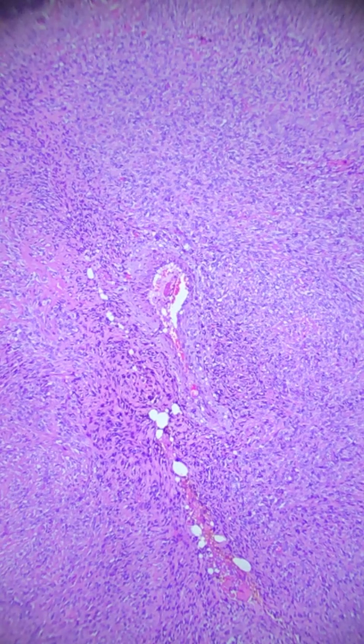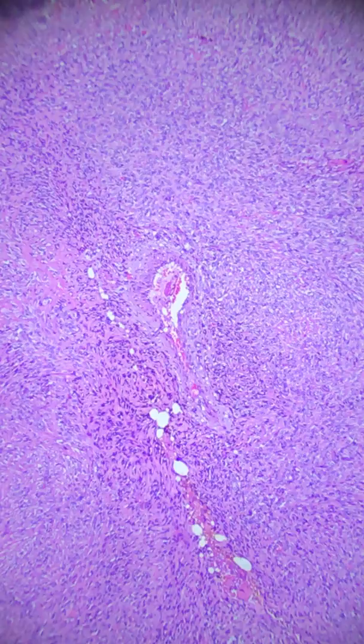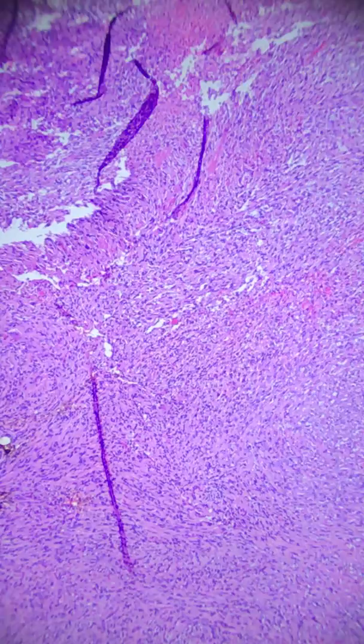Hello everyone. Today for our short review, we're going to go over another metaplastic breast cancer. What I have for you today is a spindle cell lesion of the breast. And we'll just start by driving around a little bit on this, just to give you guys a general overview of what these tumors look like.